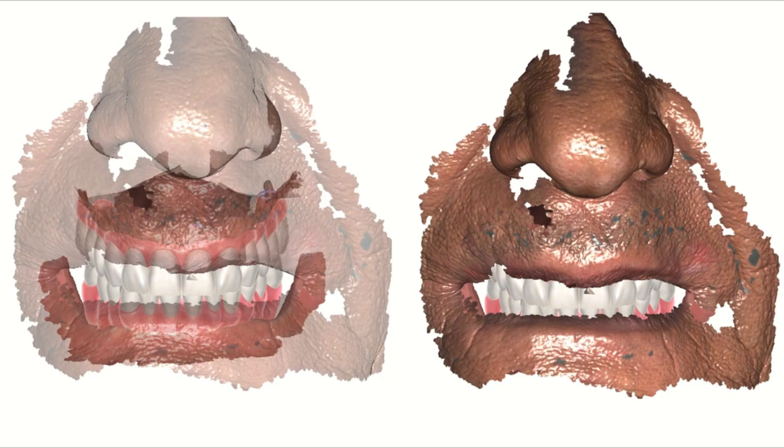Of course, it's enough for most of the cases, but for more complicated aesthetic demanding cases or full arch cases, technically demanding cases, we still need more data and more tools, of course, to obtain this data. We need to know more about the maxillary orientation according to the horizontal plane, more data about the exact lip position, and more data about the dynamic smile of the patient and the midline exact position and the movement and trajectories of the lower jaw.